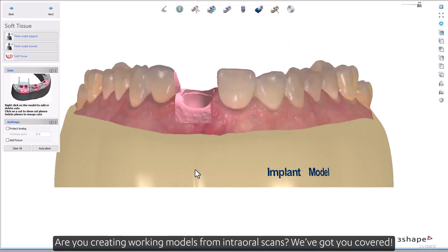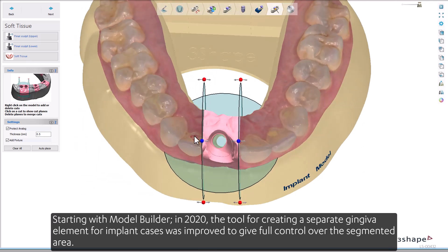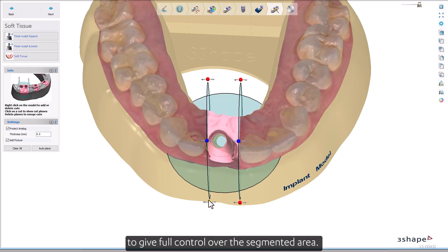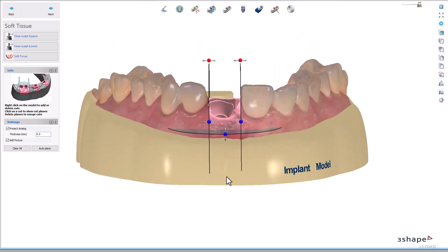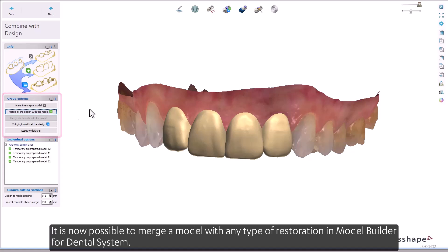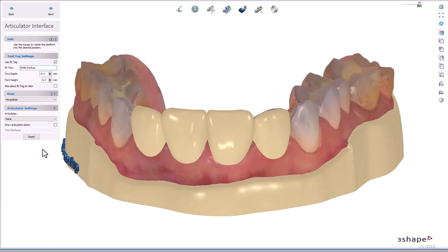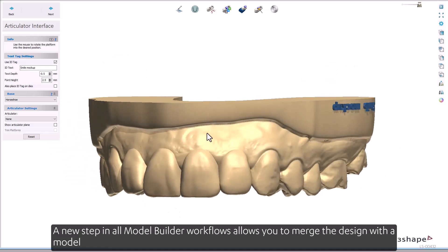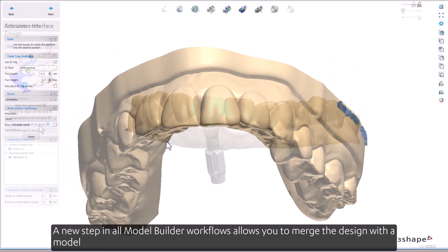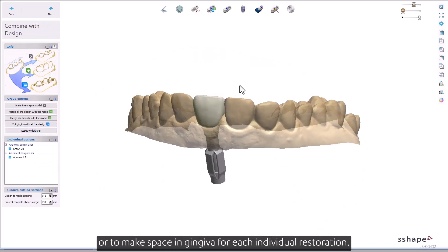For labs creating working models for intraoral scans, Model Builder has been updated starting in 2020. The tool for creating a separate gingiva element for implant cases was improved to give full control of the segmented area. It's now possible to merge a model with any type of restoration in Model Builder for Dental System — a new step in all Model Builder workflows allows you to merge the design with a model or make space in the gingiva for each individual restoration.